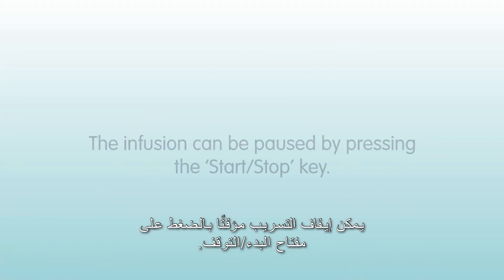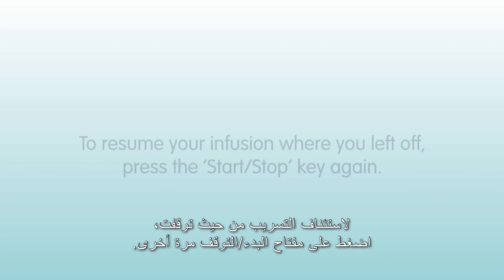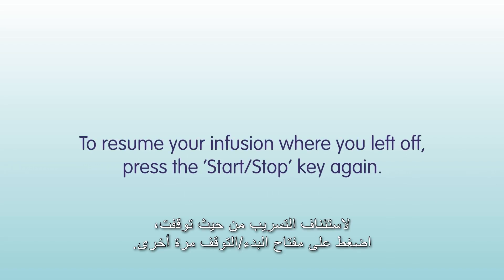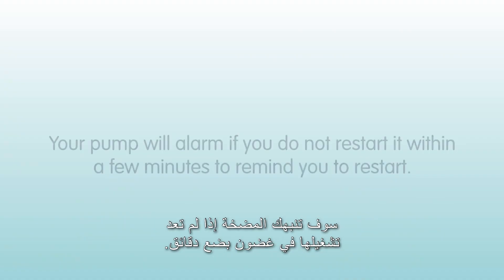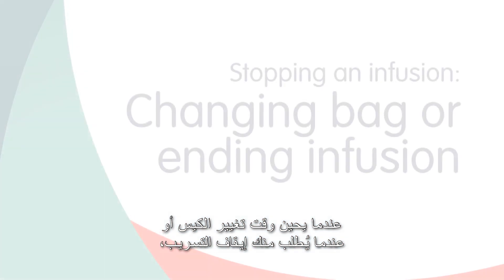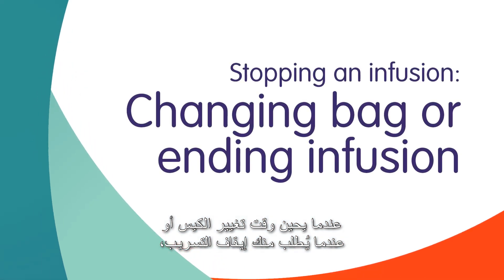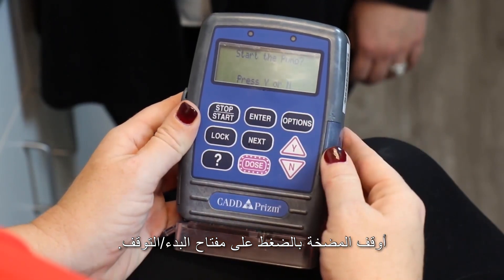The infusion can be paused by pressing the start-stop key. To resume your infusion where you left off, press the start-stop key again. Your pump will alarm if you do not restart it within a few minutes. When it is time to change the bag or you have been instructed to stop your infusion, stop the pump by pressing the start-stop key.